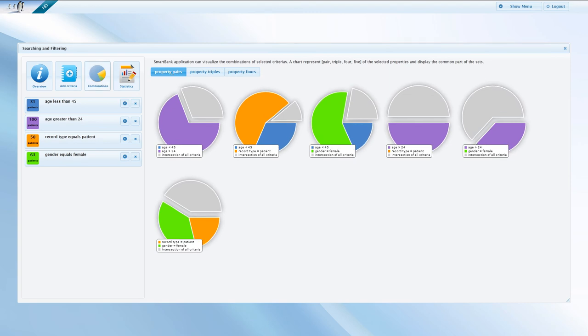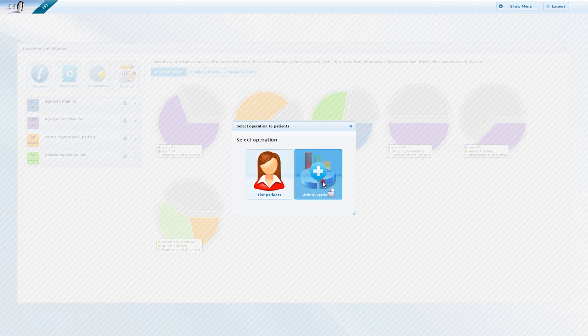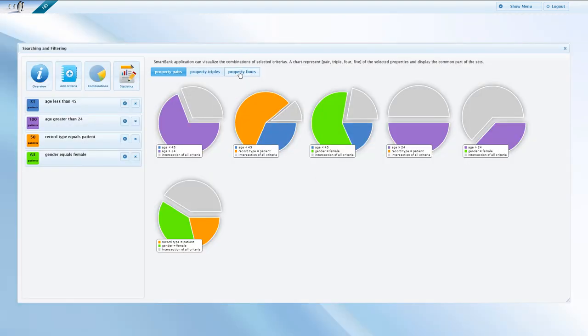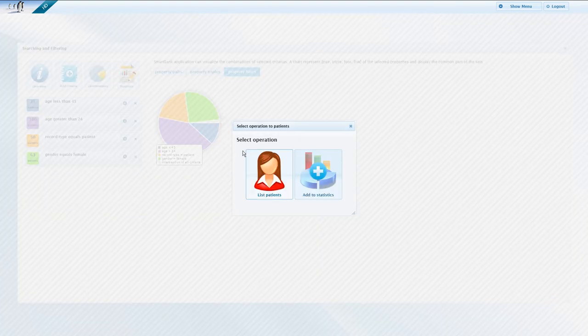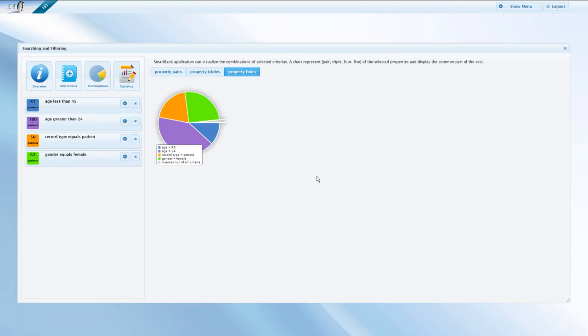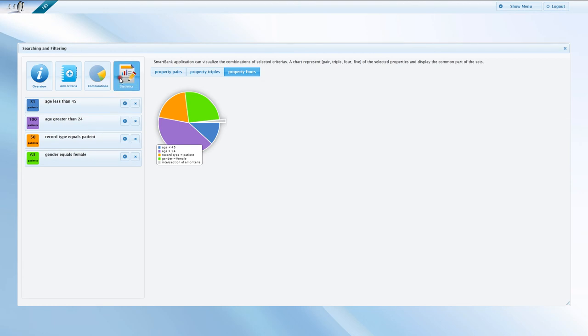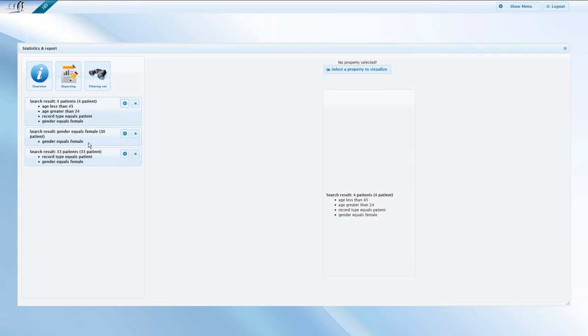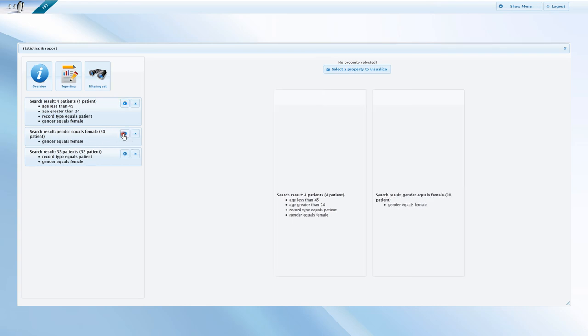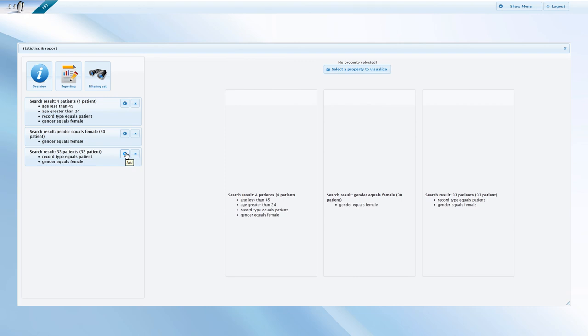We now select three different patient sets to add to statistics. By clicking on a pie chart, we can include the related criterion to the list from which the statistics will be generated. Based on the results of the filtering, we can create statistics. We can simultaneously visualize a maximum of four different criteria groups if needed. In this demo, we do three at a time. The selected criteria groups are listed on the left panel. Click on the arrow button at the selected criterion to add it to the statistics.